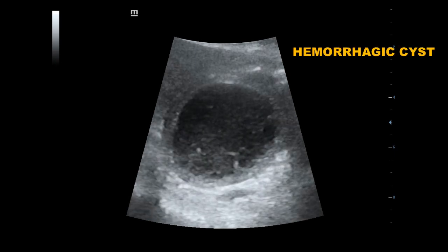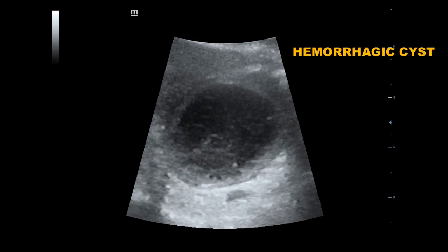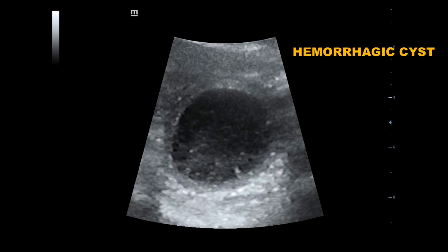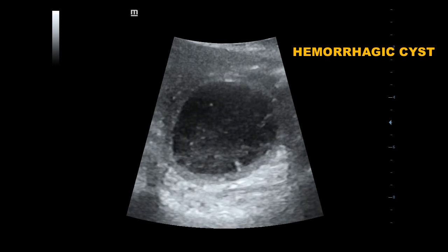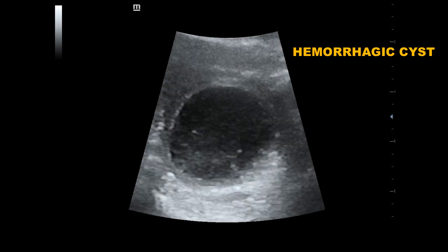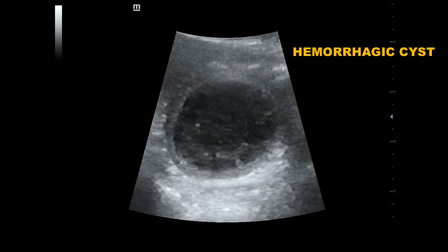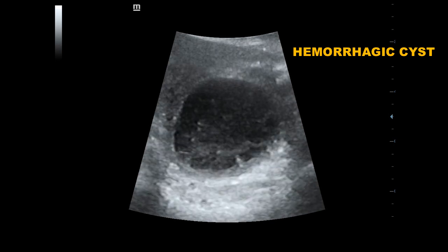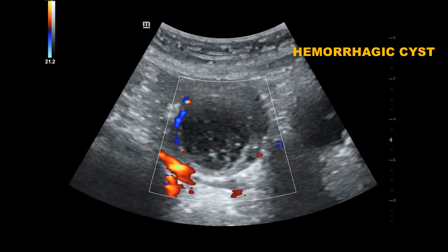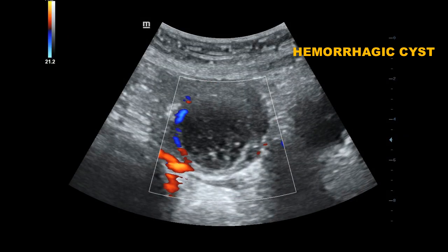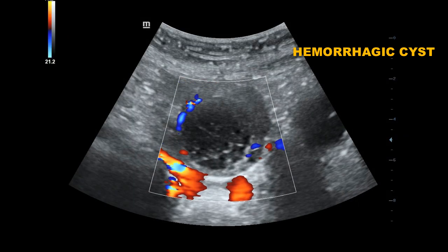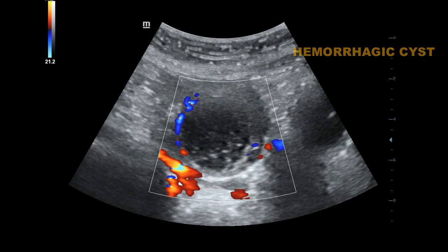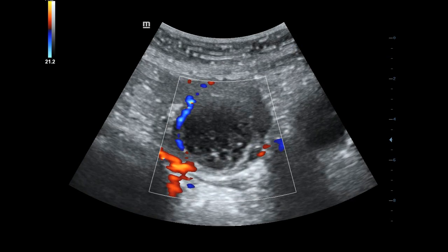This is a hemorrhagic cyst. Sometimes hemorrhage may occur in functional cysts. Here the internal pattern becomes reticular type, containing internal echoes and interdigitating septations. Color Doppler shows a peripheral ring of vascularity, but there is no vascularity within the cyst.